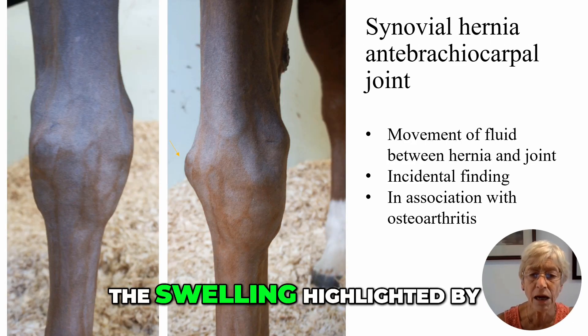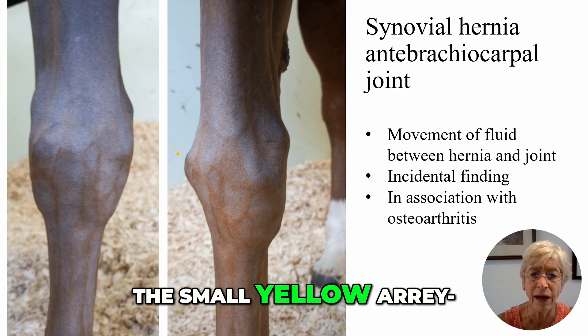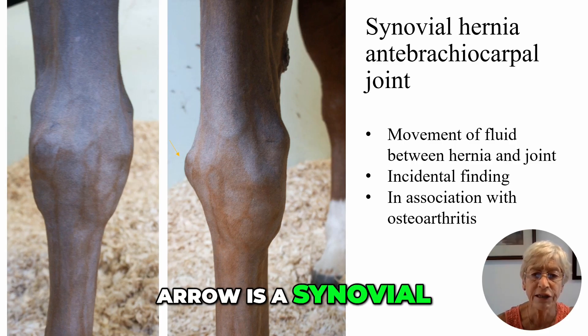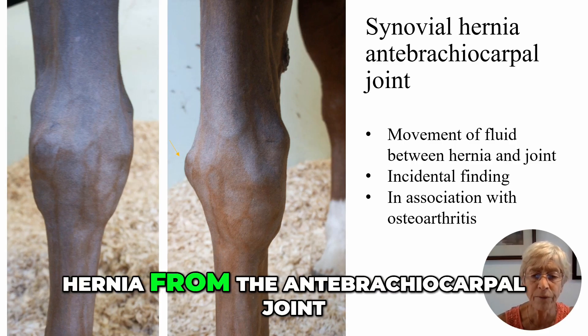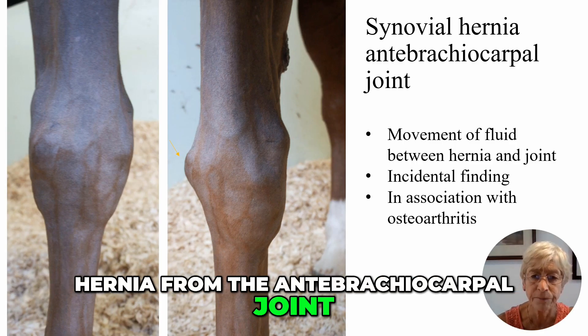The swelling highlighted by the small yellow arrow is a synovial hernia from the antebrachiocarpal joint.